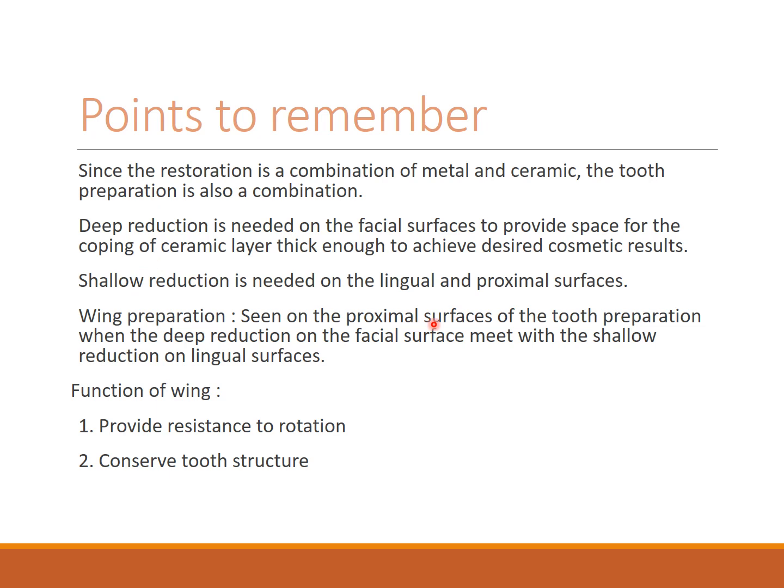Shallow preparation can be done on the lingual and proximal sides, or, guys, almost an equal preparation on all the sides, which is also fine. Usually we have a little bit more reduction on the facial side, but it's fine.